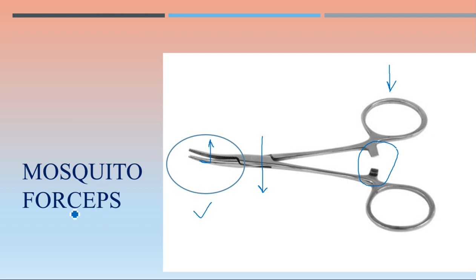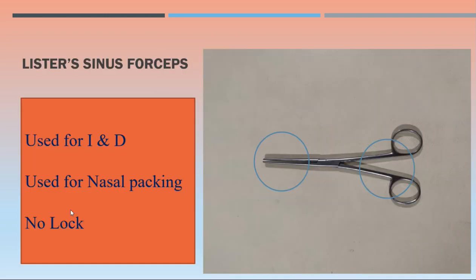The uses we will discuss in another video. This video very quickly covers just the identification part. Multiple revisions will make you perfect, at least in surgical instruments identification and their uses. So this one was mosquito forceps.